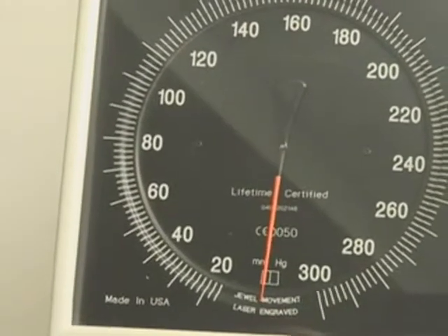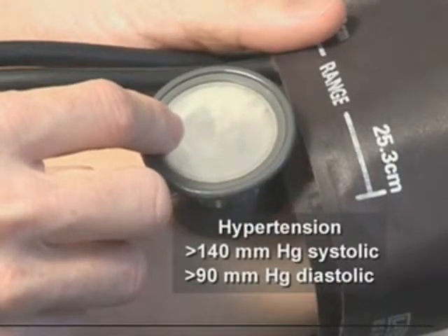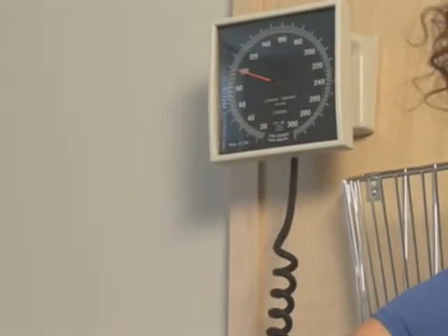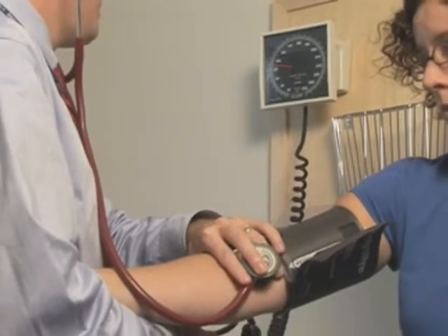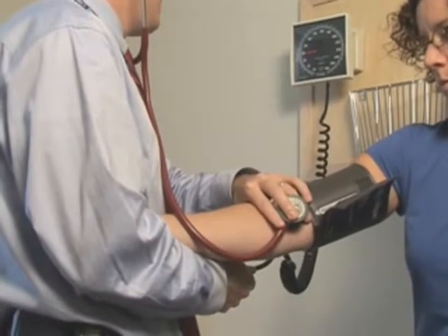Hypertension is defined as a systolic blood pressure greater than 140 millimeters of mercury or a diastolic measurement greater than 90 millimeters of mercury. The purpose of this video is to demonstrate the appropriate technique for the indirect measurement of blood pressure in adults. Blood pressure should be assessed at each office visit.